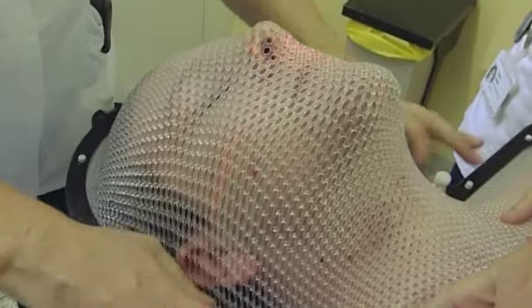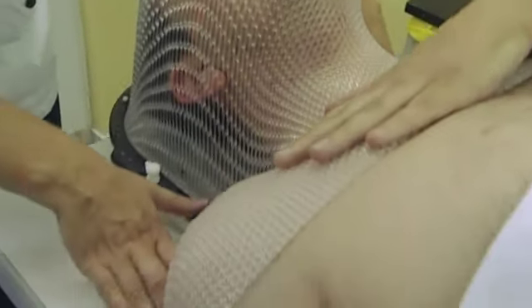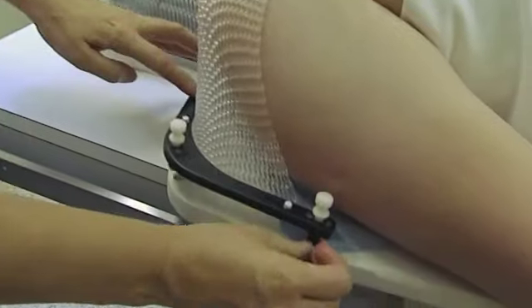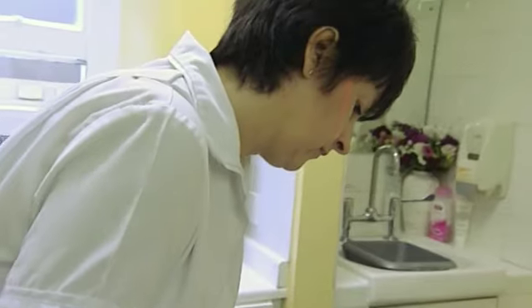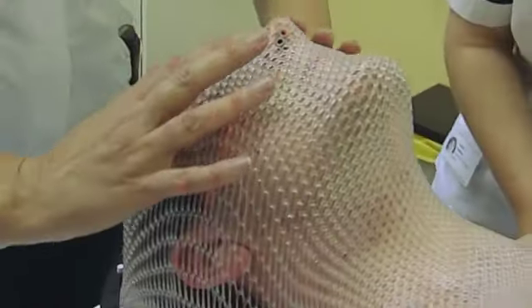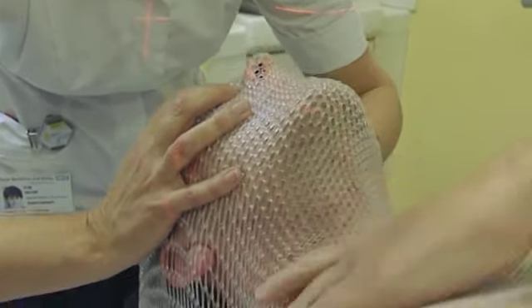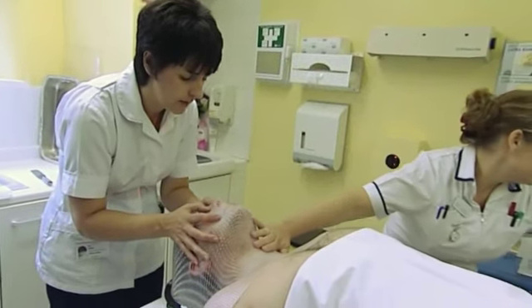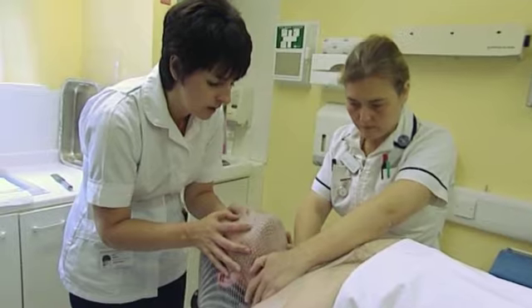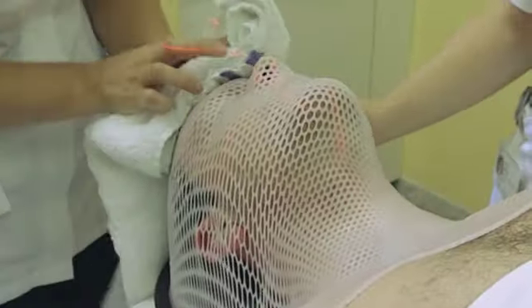That's lovely, well done. Going right down — you'll just hear those little poppers. Just feel me coming in gently around your eye area and moving your head over. Well done. We're going to pop a fan on in the room — you're just going to feel that blowing on your left-hand side, just to help the air circulate around. The Orfit needs to stay on the patient for a good 8 to 10 minutes to cool down so that it doesn't flex or change shape. There's a little bit of a shrinkage quality to it as well, so it is necessary for this time for it to cool down.